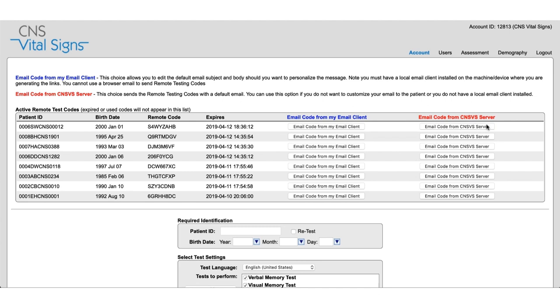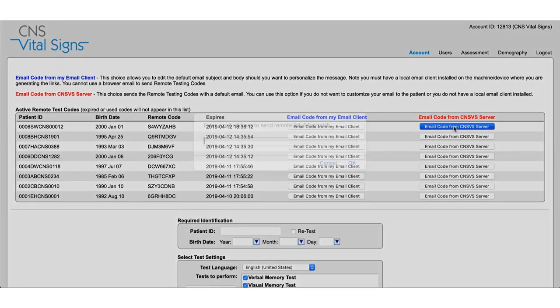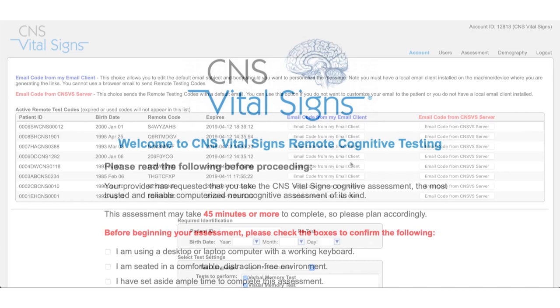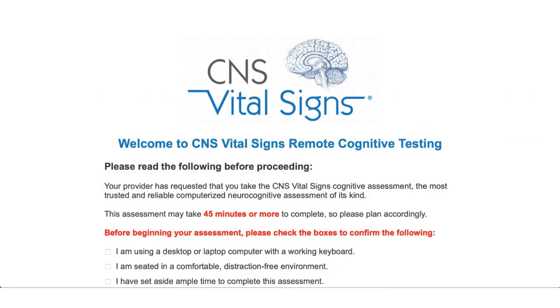You can either send it that way or you can send it through our dedicated mail server. All you need to do is enter an email address and send the test. But please note that if you do choose to send the email from our server you cannot edit the message on your own before sending it.